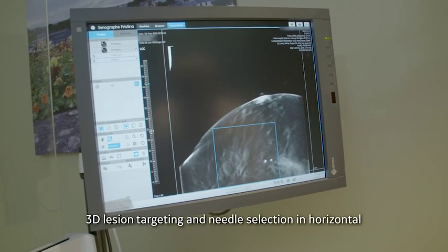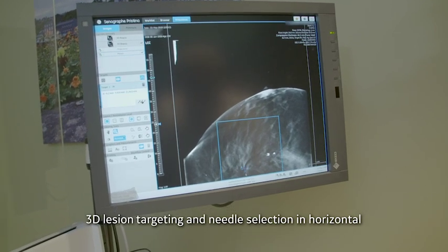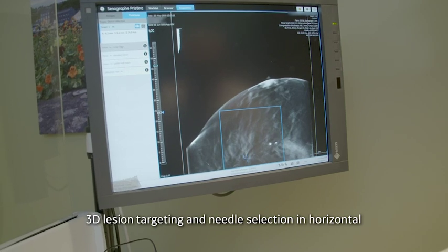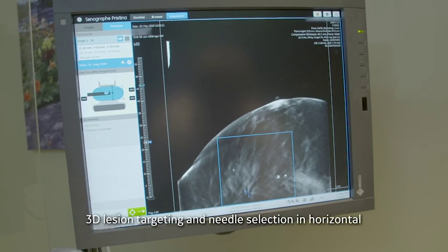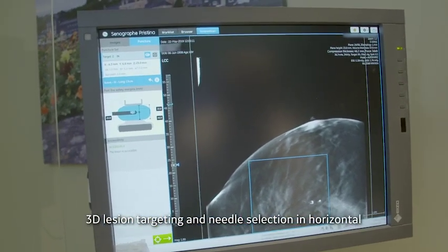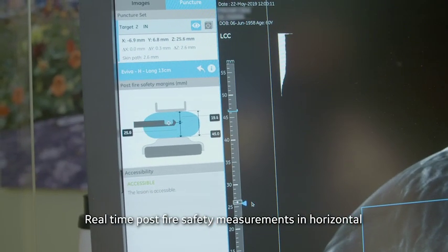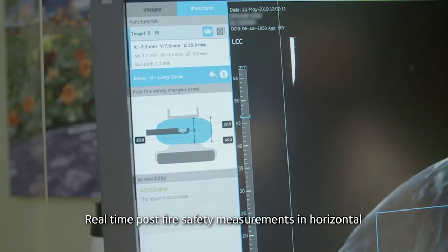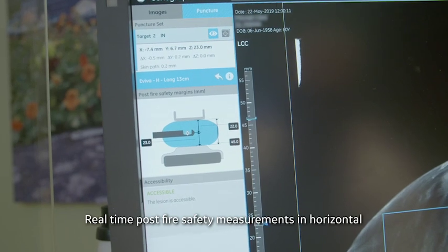Once identified, a right-click menu allows for target placement and needle selection. Any finalizing or fine-tuning is then performed. The post-fire safety icon provides the radiologist with accurate measurements, allowing him to know where the needle is within the breast for the biopsy.